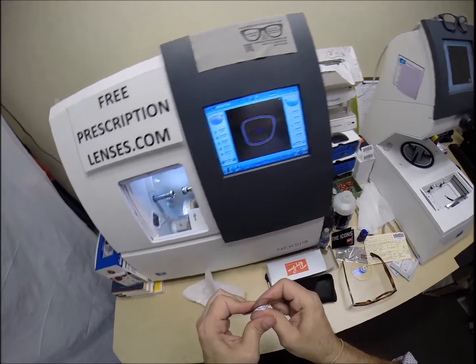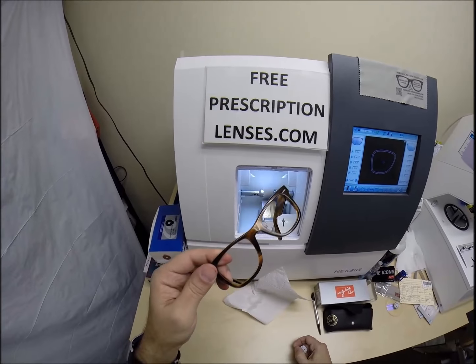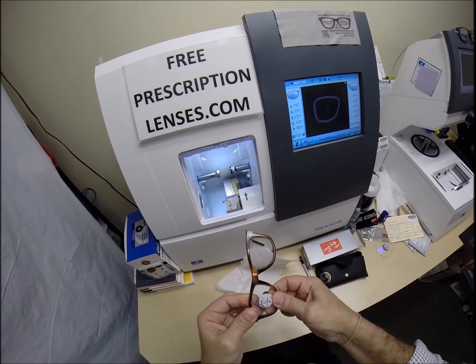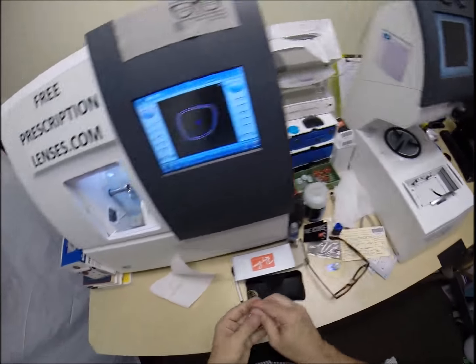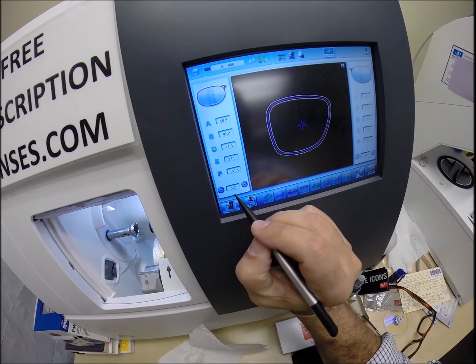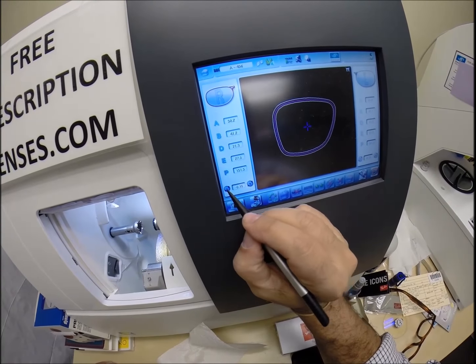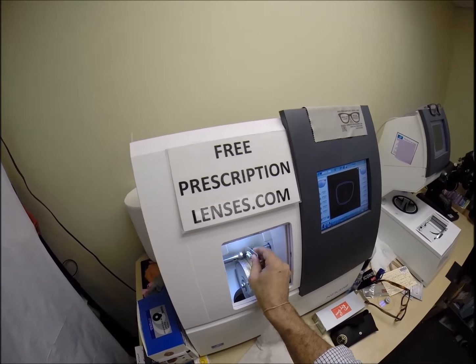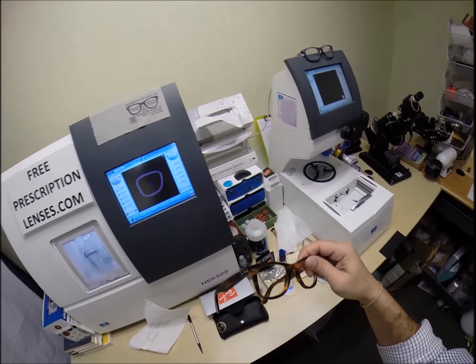So, we're going to see if this fits in there, which I'm highly skeptical. The RayBan 2140 original Wayfarer has a very deep bevel, and I'll be very skeptical if the lens fits in first time around. It doesn't. I'm going to do something daring. I'm going to take off 0.2 of a millimeter. This goes in 1/20th of a step, 0.05, 1/10 of a millimeter, 0.1. So I'm going to do 1/5 of a millimeter off the circumference of the lens, and I'm still skeptical whether it'll fit in there, and I'll do even more.